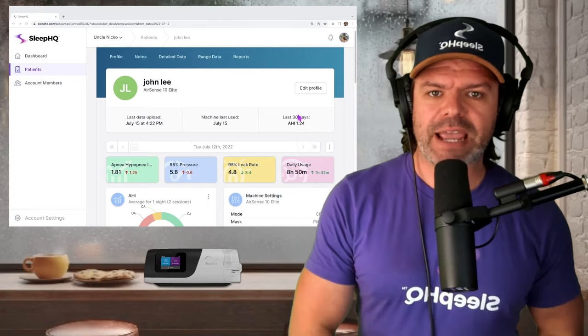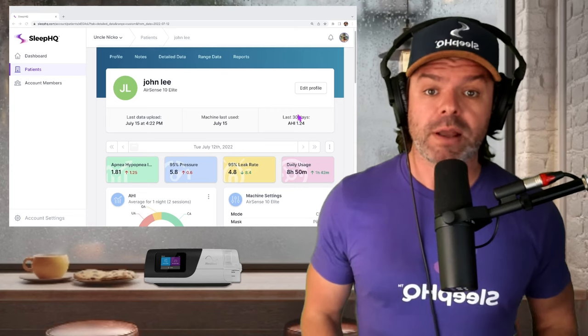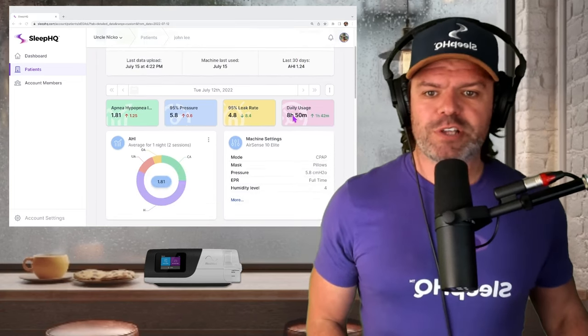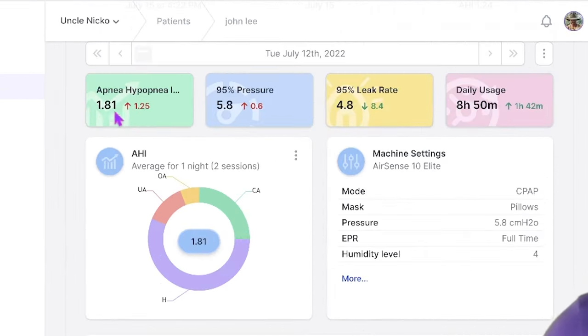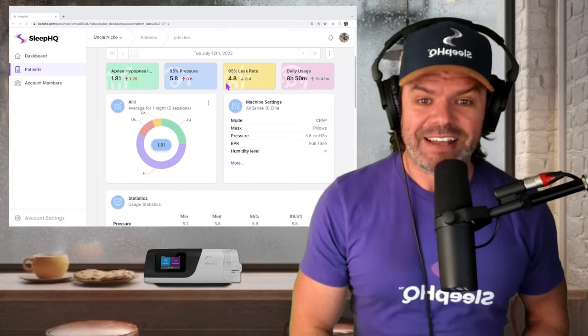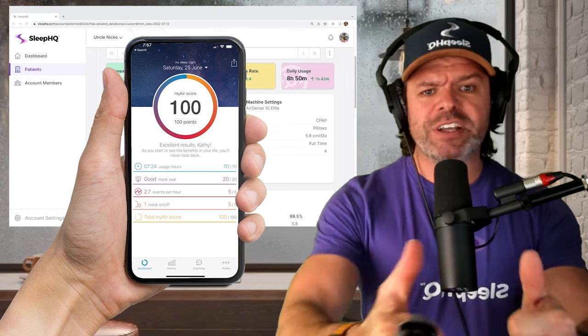G'day mates, let's jump in and take a look at John's SleepHQ report. SleepHQ is my cloud-based CPAP reporting platform and it's free to use. So here we are on Tuesday, July 12th, 2022. At face value, John's results look bloody awesome: his Apnea Hypopnea Index is 1.81 — well under five. He's on a fixed pressure of 5.8 centimeters, so it's a CPAP machine. His leak rate is 4.8, and daily usage is a healthy eight hours and fifty minutes.